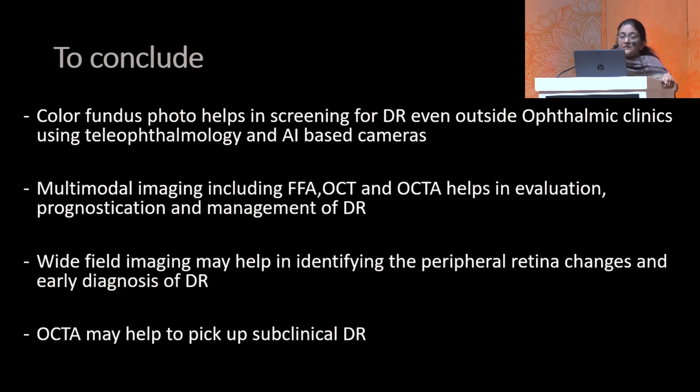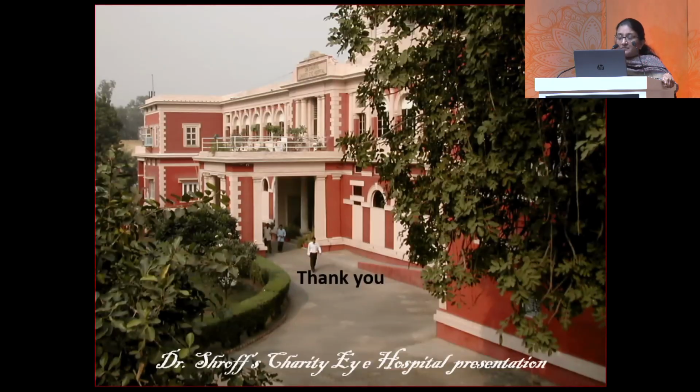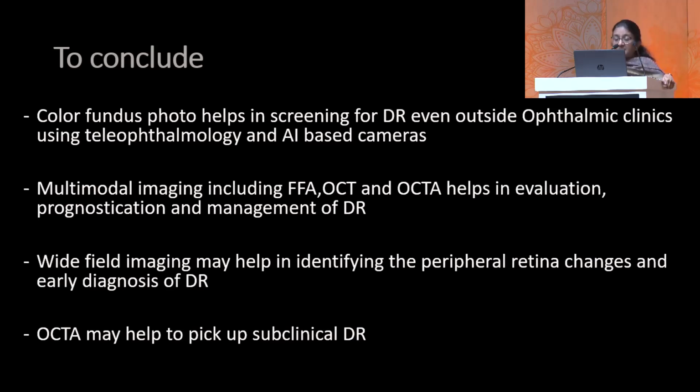Therefore, to conclude, color fundus photography helps in screening for DR even outside the ophthalmic clinics using teleophthalmology and AI-based cameras. Multimodal imaging, including FFA, OCT, and OCTA, helps in evaluation, prognostication, and management of DR. Wide field imaging may help in identifying the peripheral retinal changes and early diagnosis of DR. And OCTA may be very helpful to pick up subclinical DR, which has not been possible till today.